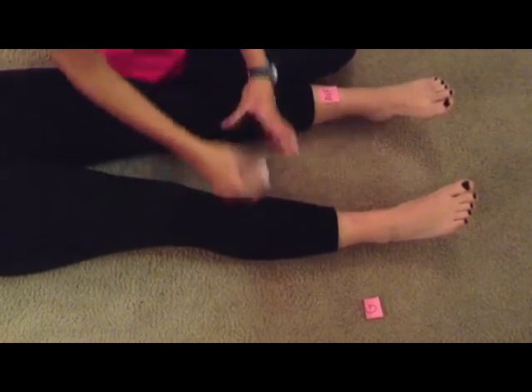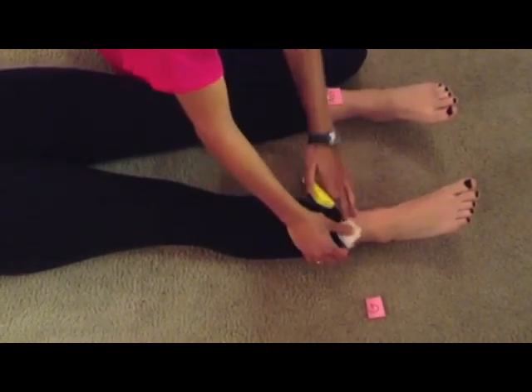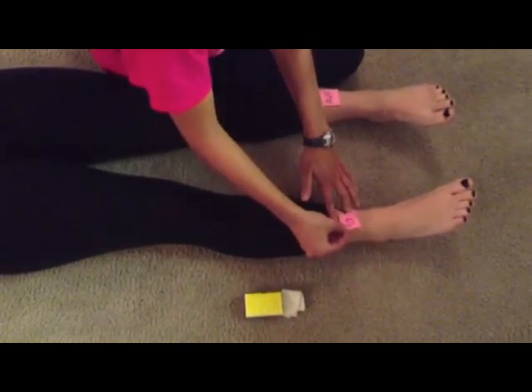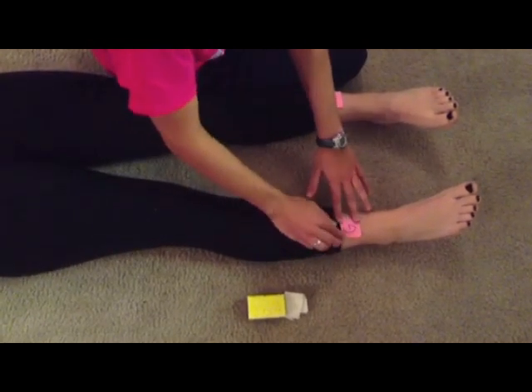On the other leg, clean right above the ankle again, followed by the abrasive pad, and place the ground electrode. The ground electrode goes on the right leg.